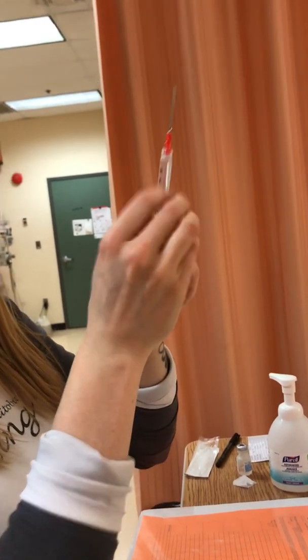I've got 1.6. One second, I'm just going to cap this safely. So 1.6 of the hydrocortisone.